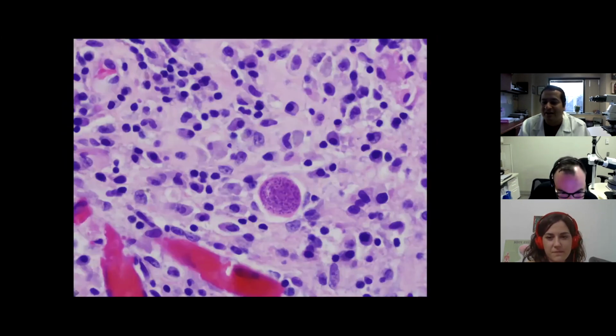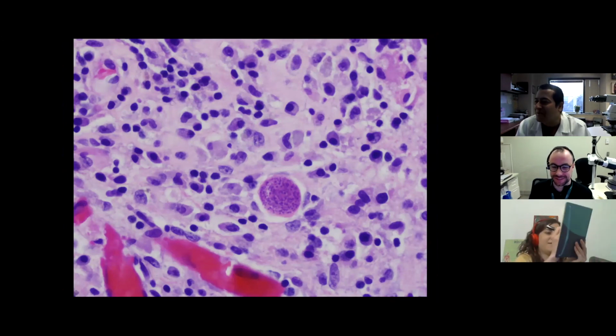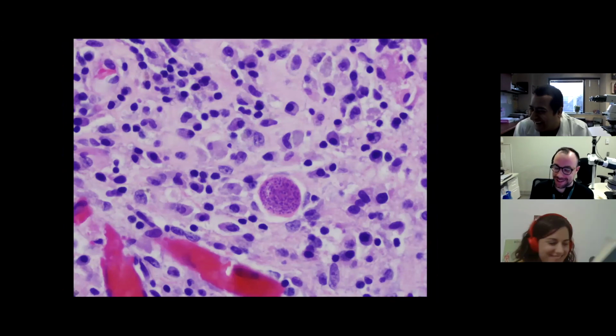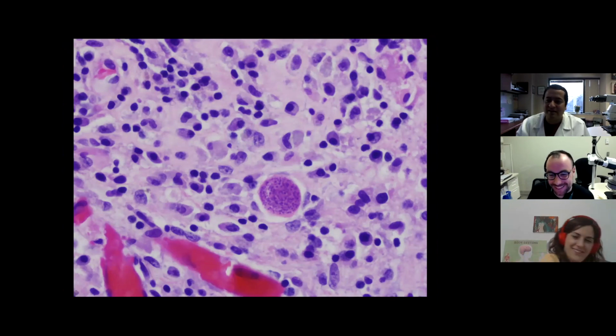Okay, here's a non-lung case, but rarely can be seen in the lung. This patient has HIV/AIDS with extremely low CD4 count and has brain lesions. Again, Irene beats Matt to the draw. You win. Yes, this is toxoplasmosis, and really, this is actually from the brain.